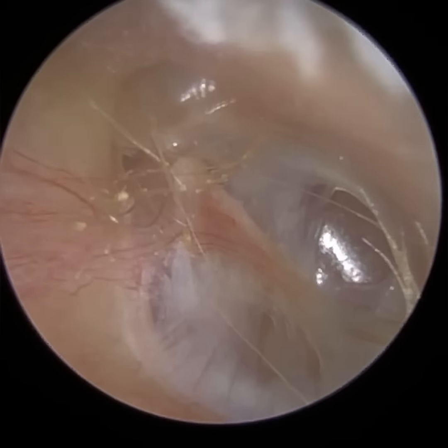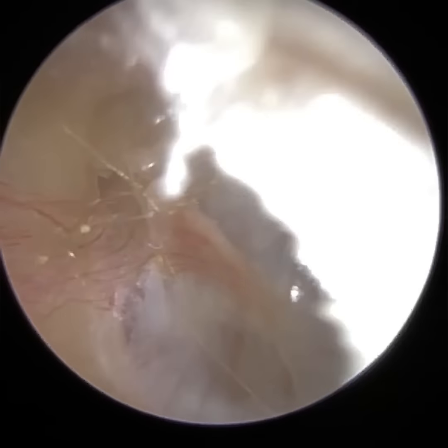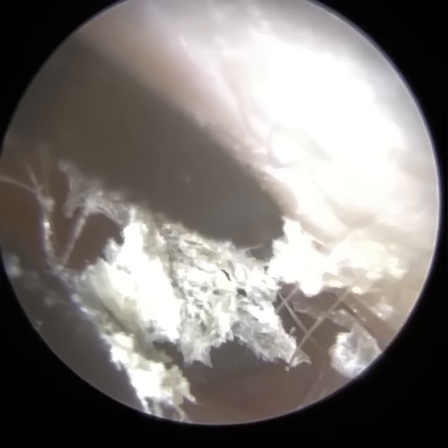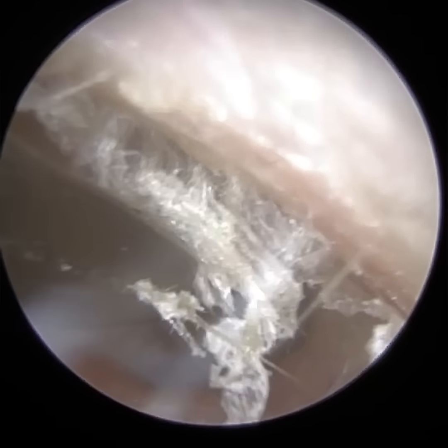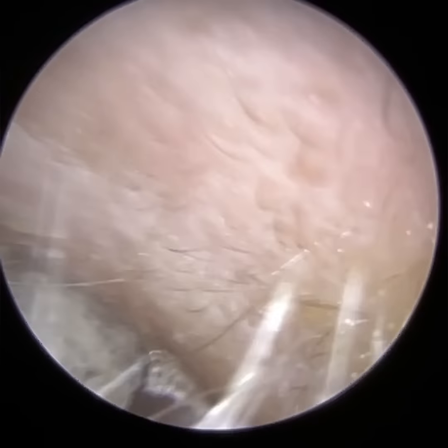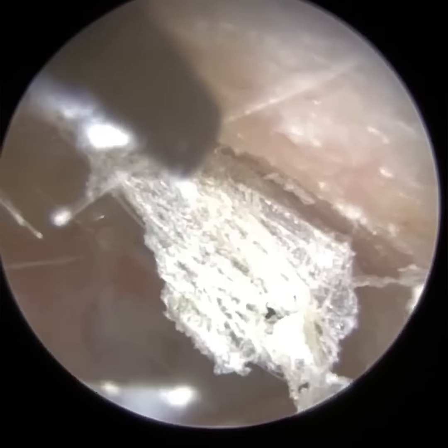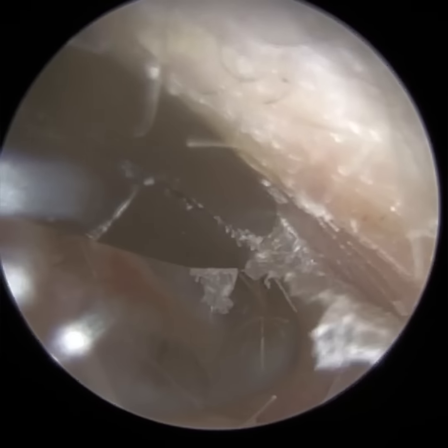So you can see that this patient is developing an autoatticotomy, so the top part of the ear canal, the bone, has eroded on top of the eardrum, and that's quite common when the patient suffers from a retraction of the eardrum. When the eardrum gets sucked inwards, the eardrum itself compresses against the bone, and it can initiate bony resorption.